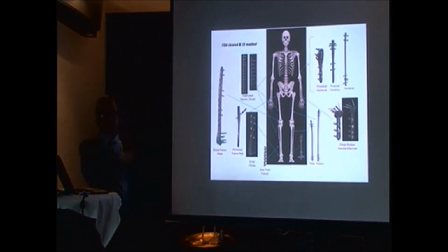So, in summary, as Devere said, they have a lot of different implants. I think the strength of the technology is the intramedullary techniques and the periarticular fractures. The only negative thing I can say is when you are used to metal that you have to bend. For example, when you have to make a wave plate, or if you have a deformity that you can take metal and bend, you can't bend carbon fiber. The bone is going to match the plate. So don't try to plate a crooked bone, because the bone is going to fit the carbon fiber.